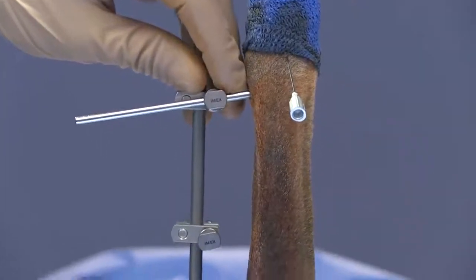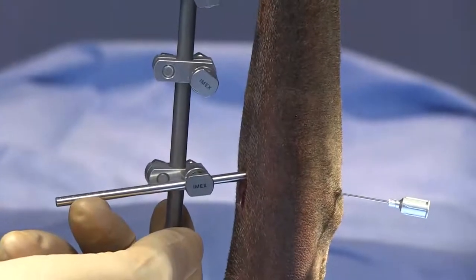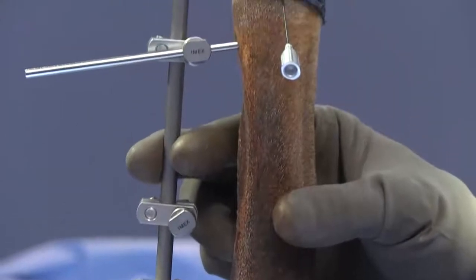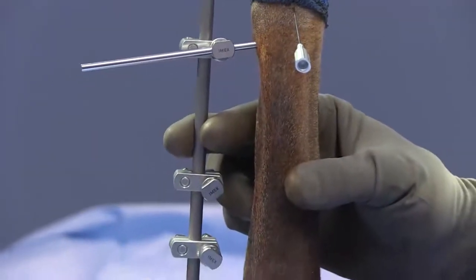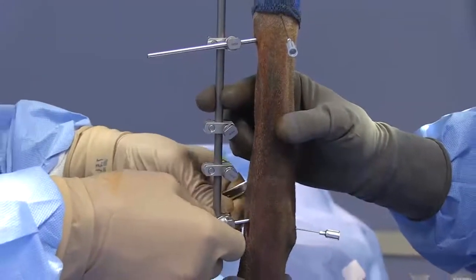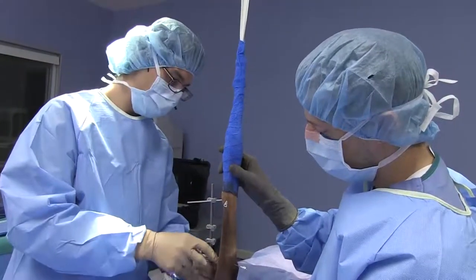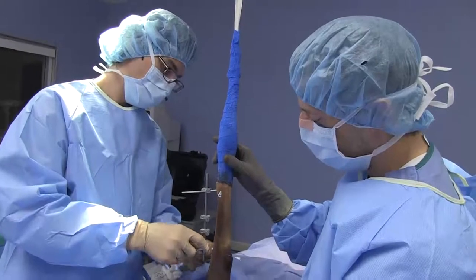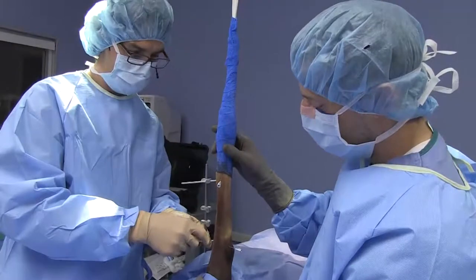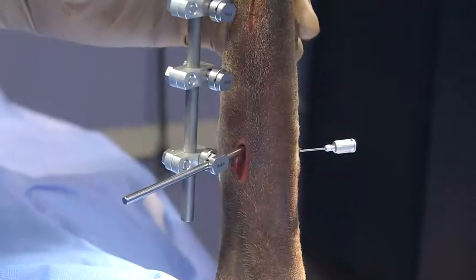We also don't want it too far out either, because that makes your construct less rigid. There is a sweet spot — not too far out, but not too far in. Right about there seems to be an appropriate position. We'll hold that and get the initial clamps engaged, then place our next pins. I usually don't snug these down too tight at this point in case we have to make any additional adjustments, but enough so it's not slipping around.